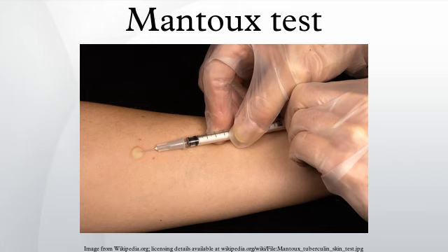Guidelines for its use were released by the CDC in December 2005. QuantiFERON-TB Gold is FDA approved in the United States, has CE mark approval in Europe and has been approved by the MHLW in Japan.